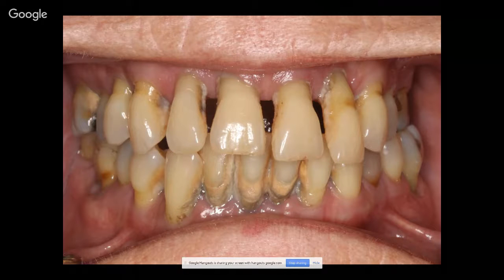What I want to drive home is, I've pointed out in the first 2 cases that soft tissue is probably one of the most important things that I stress nowadays in full arch cases, because I see it's an underutilized therapy, and an overlooked therapy across all presentations that I'm seeing now. And it's a very difficult process to be able to get thick tissue on a case that has full arch reconstruction, extracting teeth and placing implants at the same time.